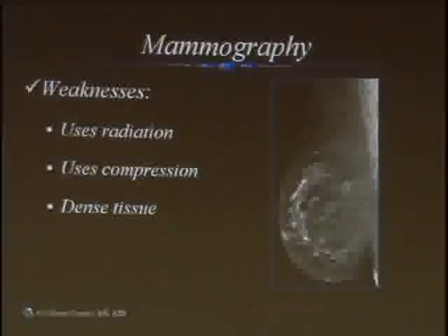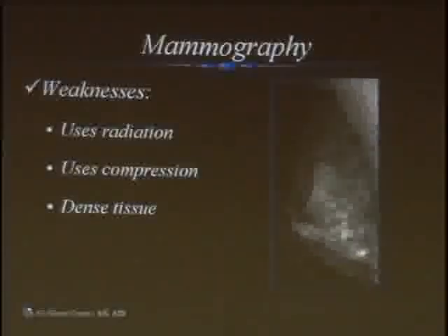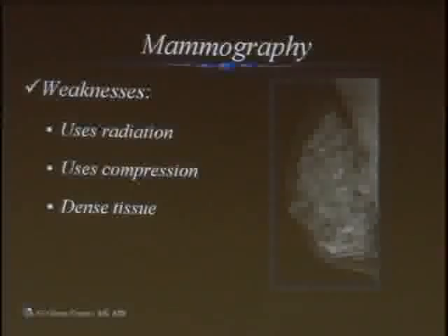You get a little younger, or you are a little younger, or your genetics or your body habitus are different. You might have scattered fibroglandular elements. This is breast tissue, the white. So this is breast tissue in a sea of fat. Okay, so it's slightly denser. Dense is white. The muscle is very dense. The tissue is dense. Fat is not dense. Okay. The next step is heterogeneously dense. A little whiter, huh? And then you get the next step up, which is extremely dense. Okay, this is a lot of breast parenchyma in there, no fat.